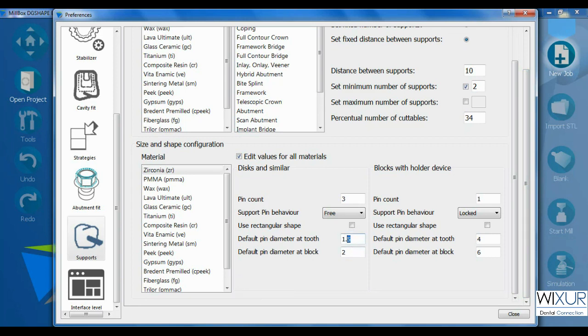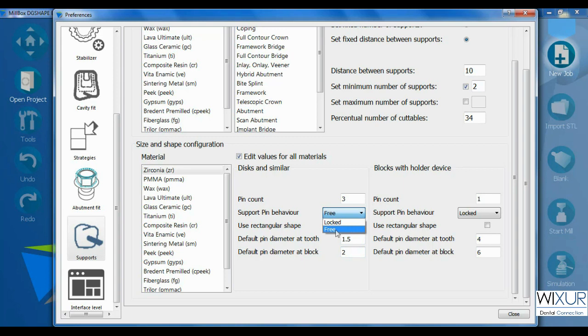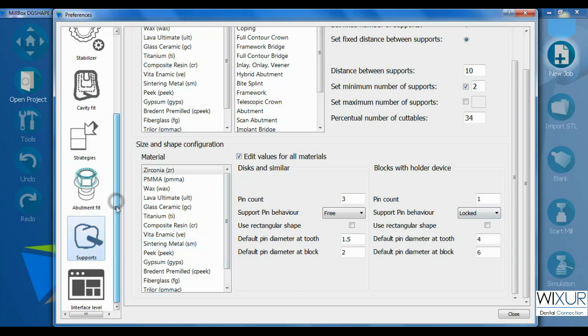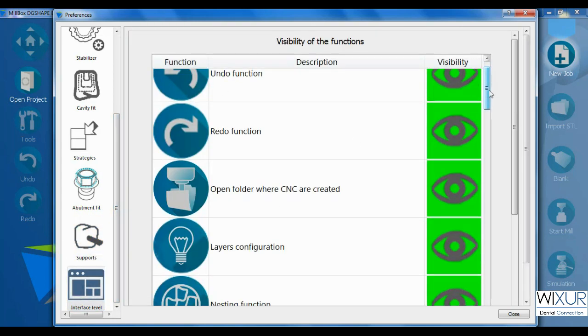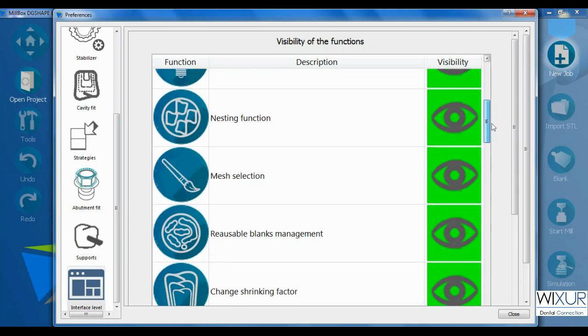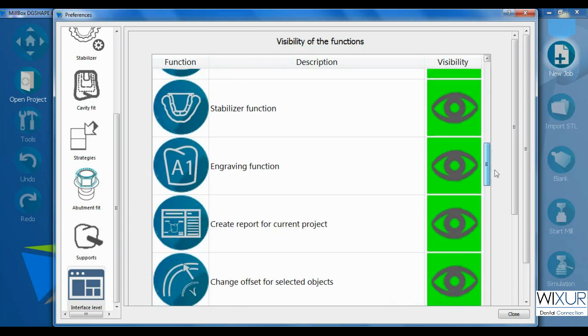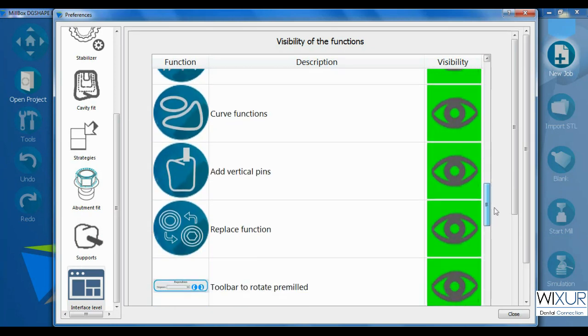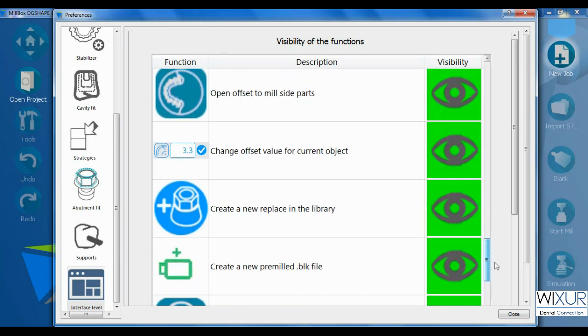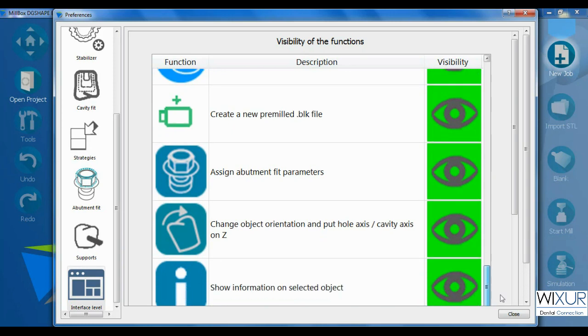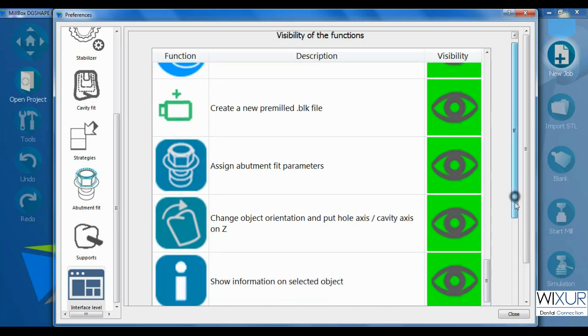Furthermore, it is possible to change the pin diameter at the start or end point. Support pin behavior should be free to be able to reposition them in software. And finally, in interface tab I can make software functions visible or if they are not used hide them.